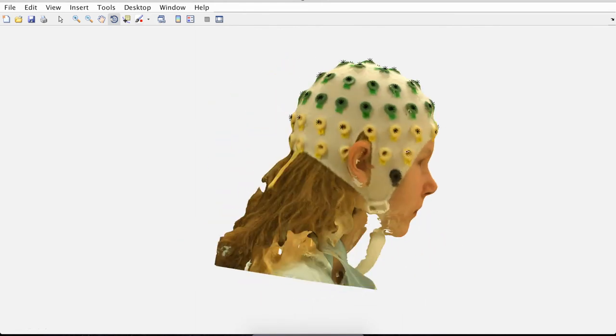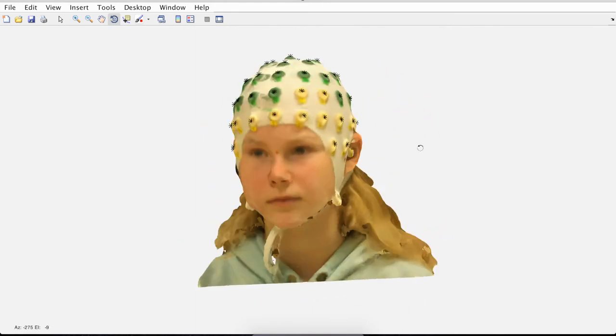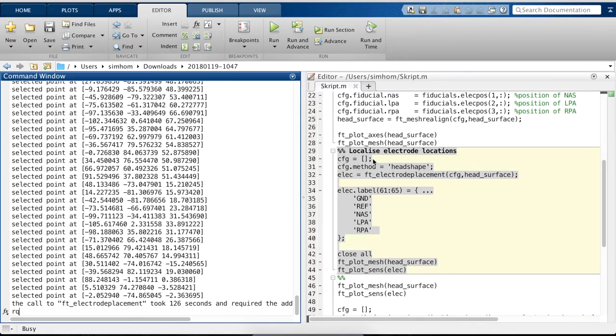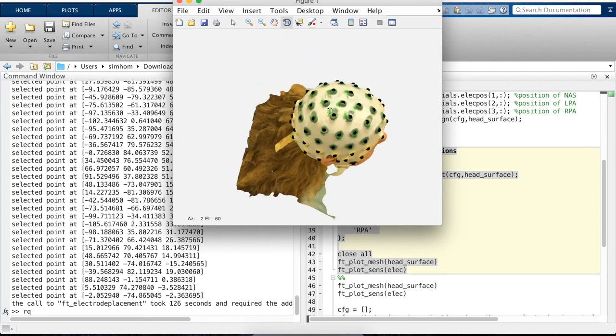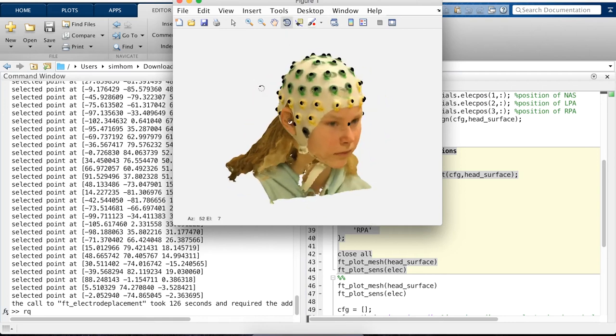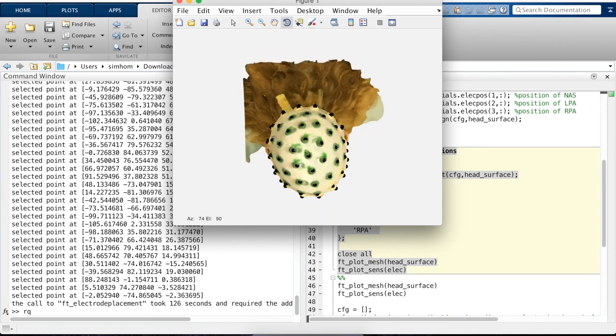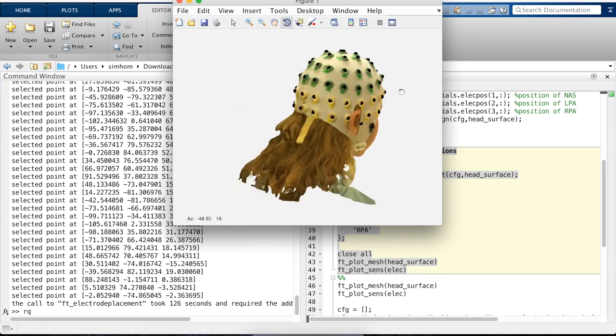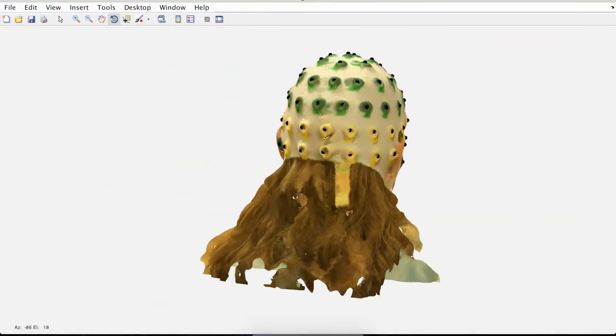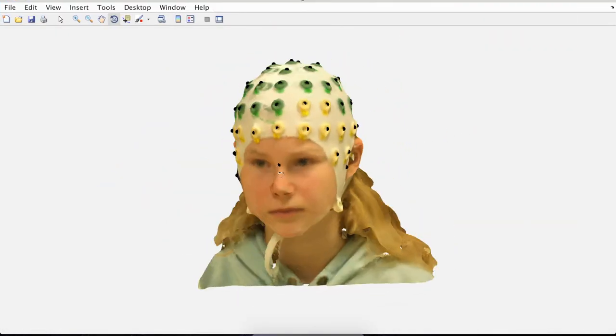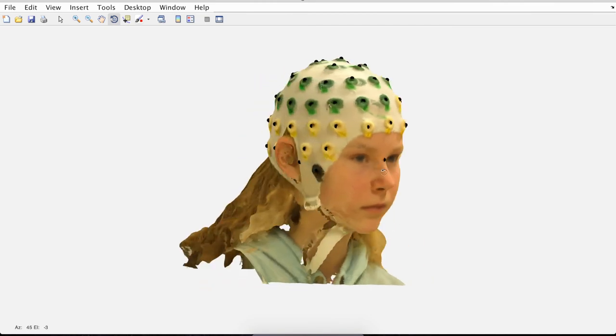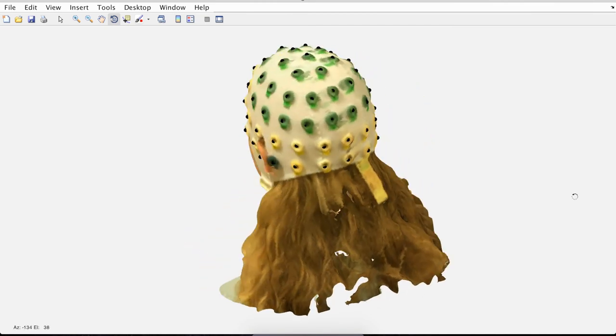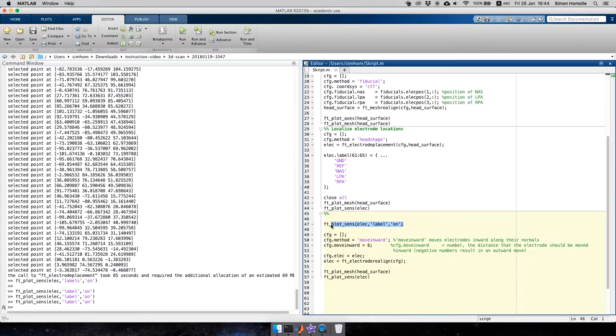And you have to click in the specific order that you want to have it because now the first electrode you click is the first in the dataset. And the last one you click is the last one in the dataset. Now we can actually see how we localize the electrodes. The black spots are the ones where we clicked. And when we rotate it, you can see the electrodes are nicely aligned to the head where the electrodes are. Again, we can rotate to see it better. And if you're happy, you can leave the dataset. If you're not happy, you can just do it all over again.